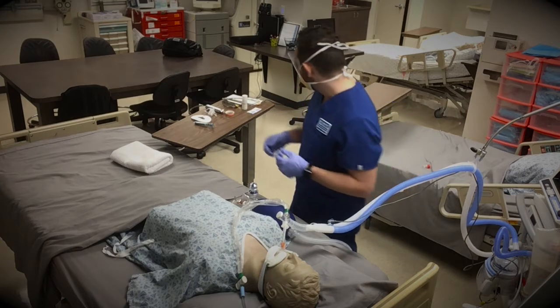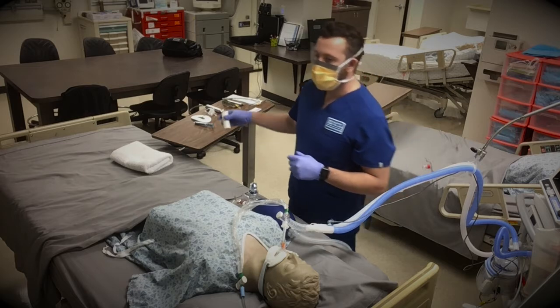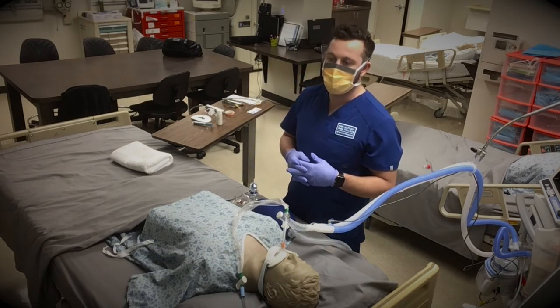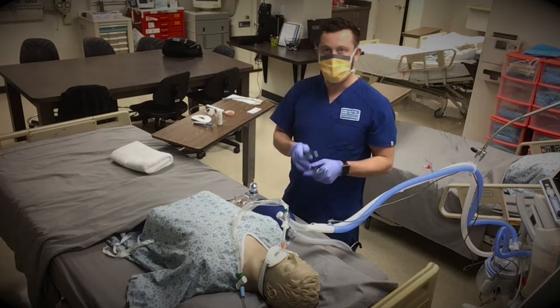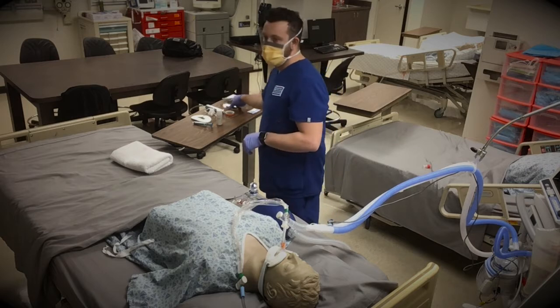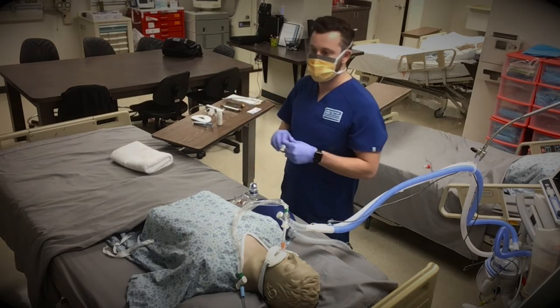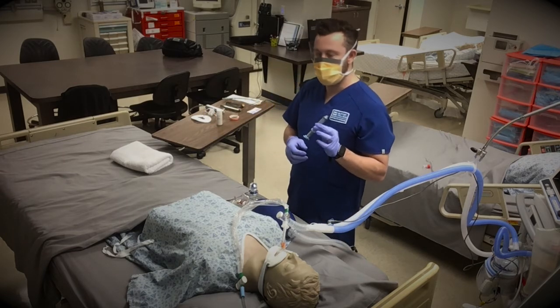You need some water-soluble lubricant and your intubation equipment, such as your laryngoscope blade, Mac and Miller, tape, and a syringe to deflate the cuff.